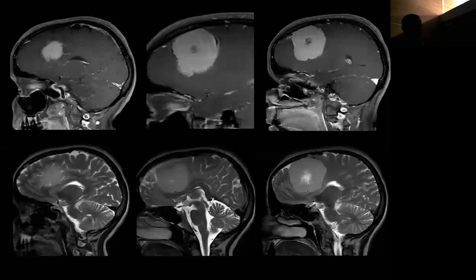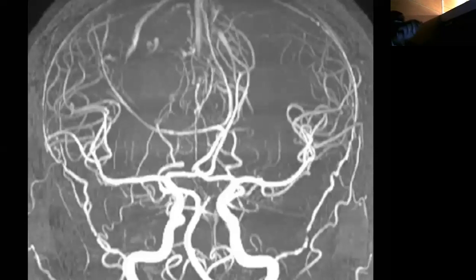The beginning of A2s, branching. And the MRA: this is the right carotid, paraclival, the cavernous part, the intracranial part, middle cerebral, anterior cerebral. Same thing here: cavernous part, middle cerebral, anterior cerebral. This is A1 on the left, this is A1 on the right, this is A2 on the right, A2 on the left. Let's follow the left. A2 is going like this, while this A2 on the right is dividing here inside the tumor.